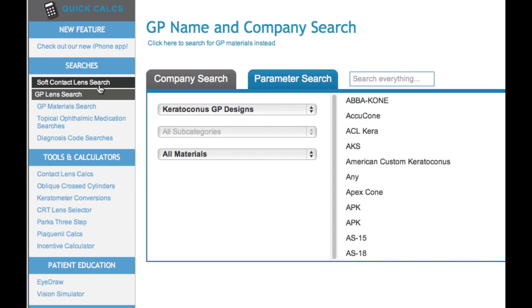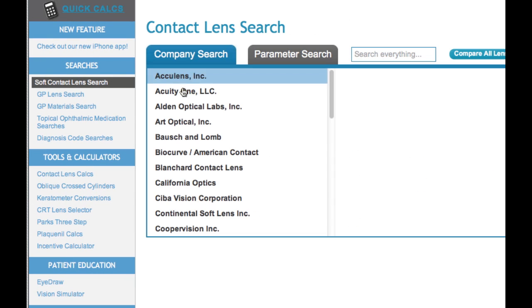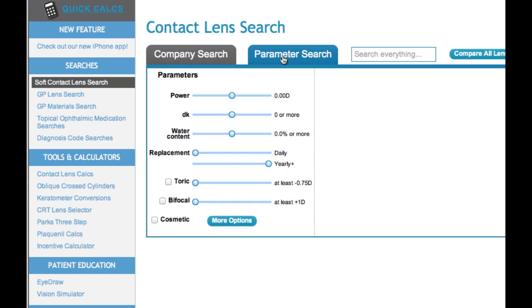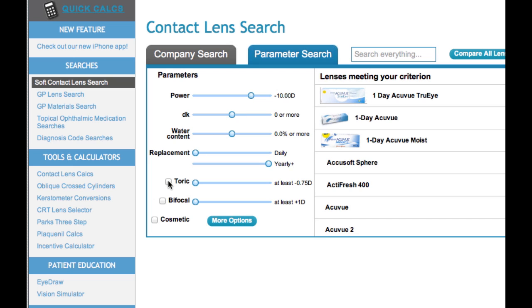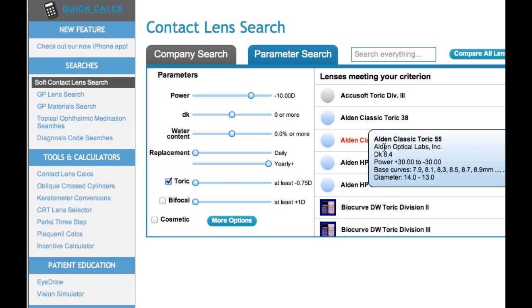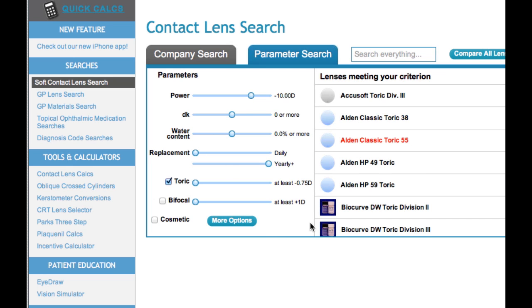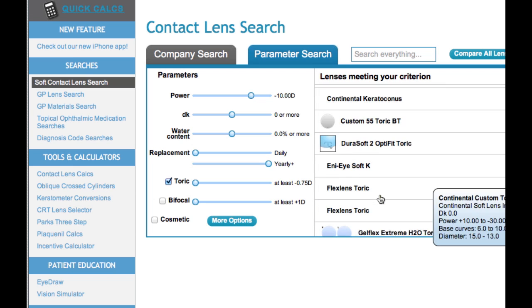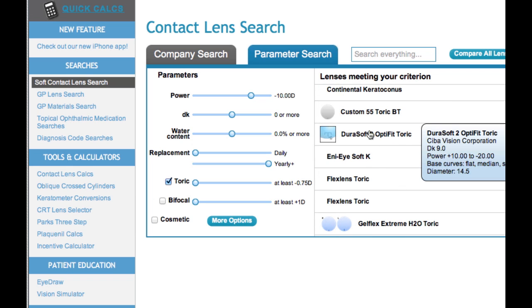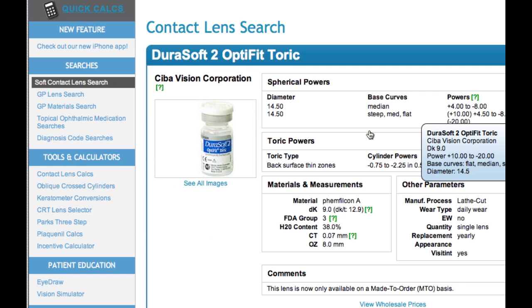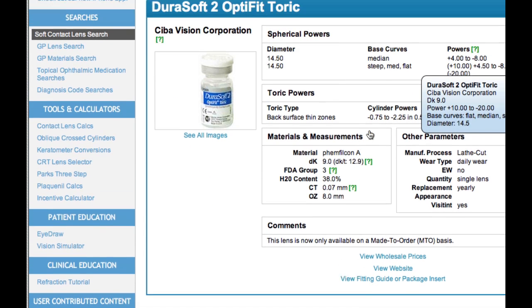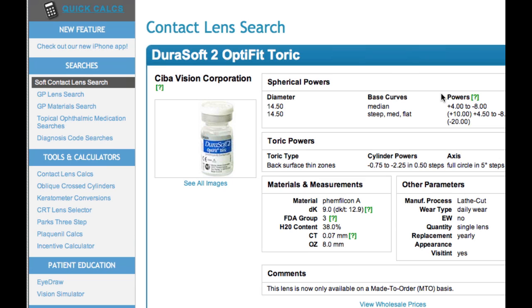We still have the soft lens searches, of course, and that works in a very similar way. You can look by company, you can do parameter searches. We have sliders like we did on the old site, but now we can get more immediate results. And if you hover over the results, you can get a little bit more information about the lens, or click on it and it'll give you the full listing. So I hope that's a good introduction to our new features, and I hope you check them out. Thank you.